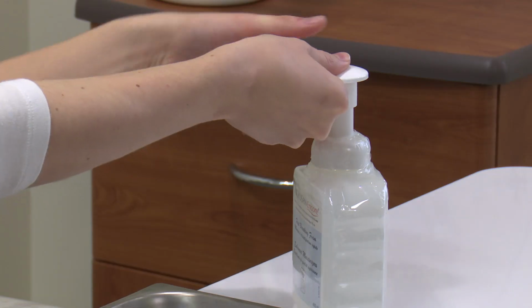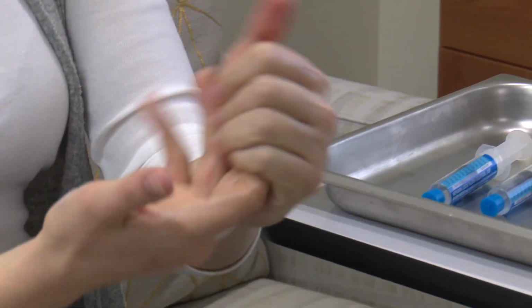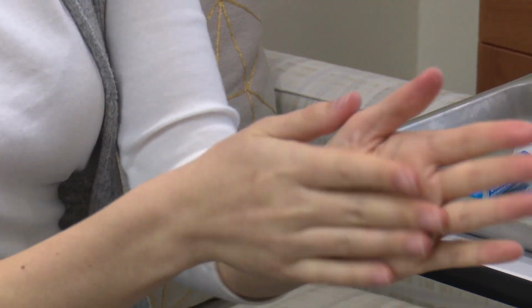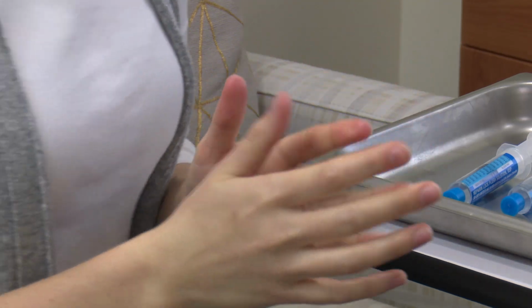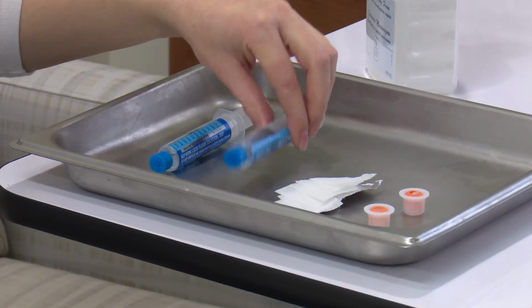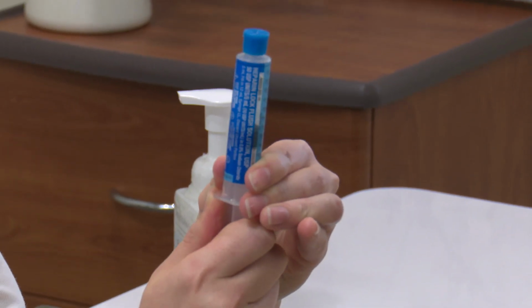Sanitize or clean your hands. Pick up the heparin syringe. Keeping the cap on the heparin syringe, pull the plunger back until you feel the plunger move and hear a pop sound.